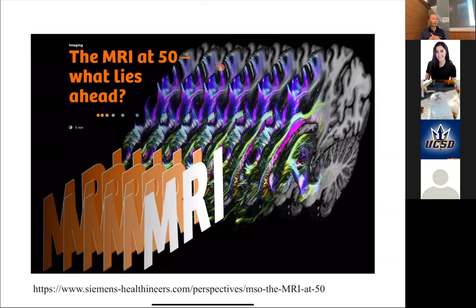In research, we even go to extremes. For fMRI, it used to be more popular than it is now, but we had bite bars. So you'd actually go in the magnet and clench your teeth onto a bar and just hold it the whole time so you wouldn't move your head, right? And now we have inflatable things that you inflate around the head to keep it from moving. So it is still an issue. Good question. Any other question?